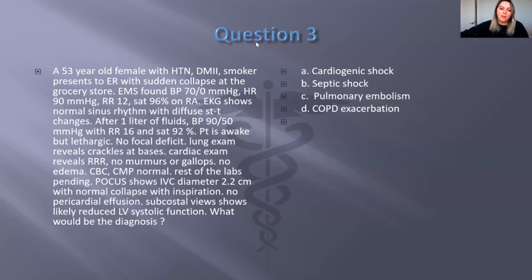Any tips on obtaining beautiful IVC views like the ones in your presentation? I would say 90% of our patients have a good IVC view. The main thing is to really press, and sometimes you press too much and you lose the IVC. So you have to start with the superficial view and look at the liver, and then slowly press deep down. But keep looking at the ribs. Don't look down too much, because then you will start looking at the stomach or intestine.